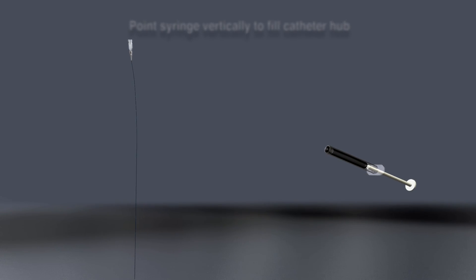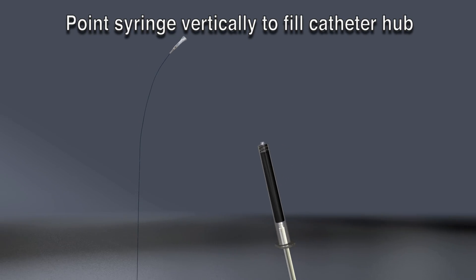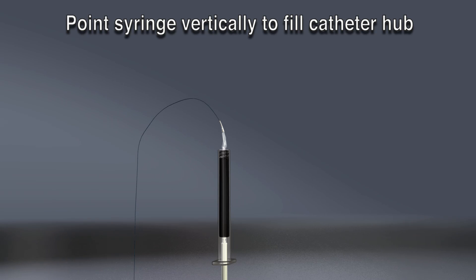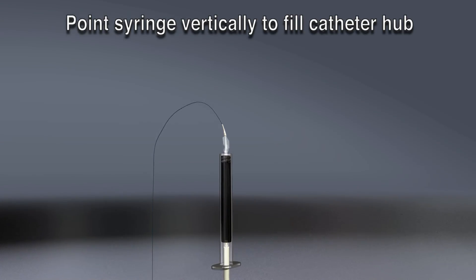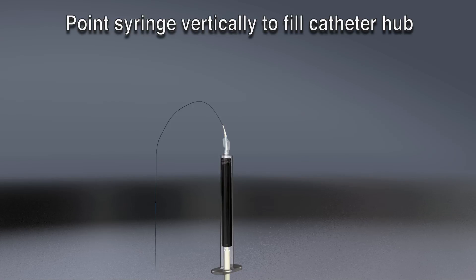Immediately, take the Onyx syringe and point it vertically with the tip pointing up. Invert the hub of the catheter and connect it to the Onyx syringe, making sure there is no air in the hub during the connection. Be sure the luer does not contact any saline, blood, or contrast. To avoid Onyx dilution with DMSO, continue to point the syringe vertically.